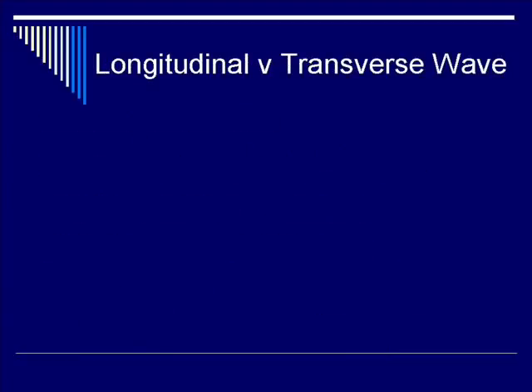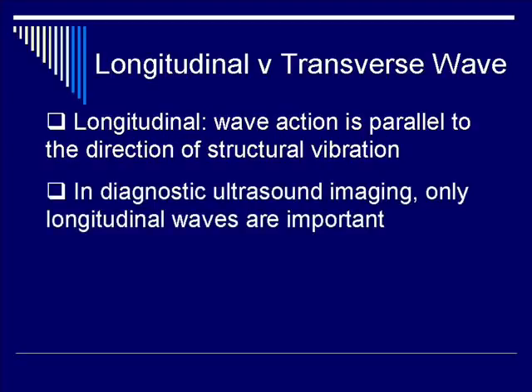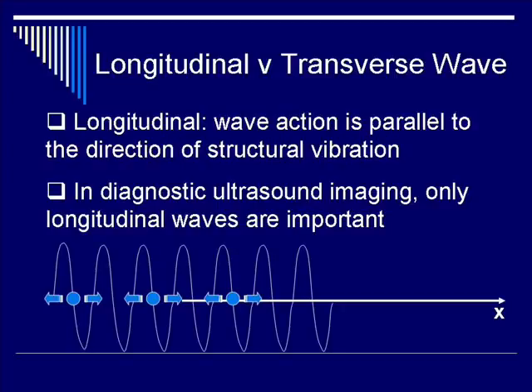Sound waves can be longitudinal or they could be transverse. In longitudinal waves, the wave action is parallel to the direction of the structural vibration. In medical ultrasound, only longitudinal waves are important. As is seen in the next figure, the blue molecules representing the medium, as they are influenced by the incoming sound waves, do not actually move. However, they do oscillate about their equilibrium positions. In the picture, they're depicted as moving left and right of their equilibrium position.